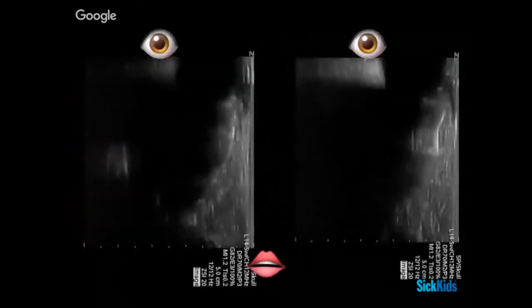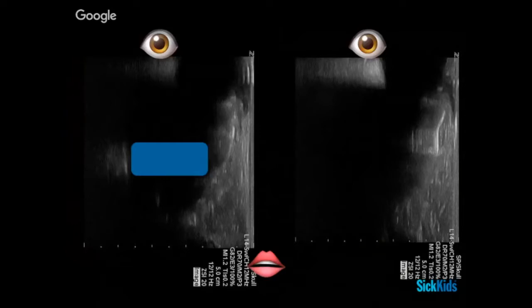For those of you who have problems tilting your head, I've now made my strange face go the right way up so we can hopefully appreciate it a little bit better. So at the top of your screen should be your eye. Remember, your transducer is going longitudinally along the face. Then we have this pocket of air with all of a sudden on the left-hand side of your screen, a visible posterior wall compared to the right-hand side, and then the bottom of that transducer near the lips or chin. To make it a little more apparent, I've drawn in the fluid for you. We're not going to be able to visualize all the fluid itself, but it gives you a sense of what we're looking at.